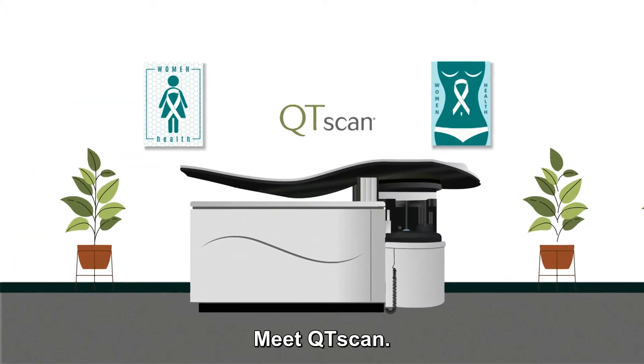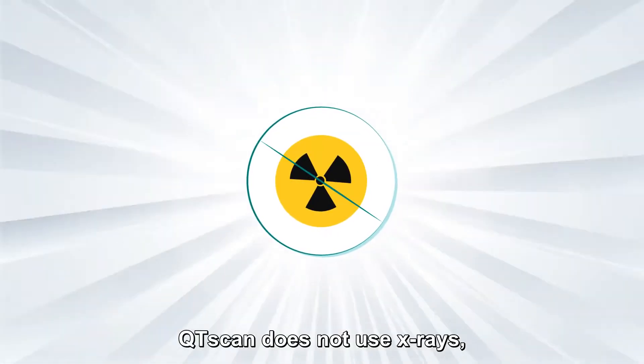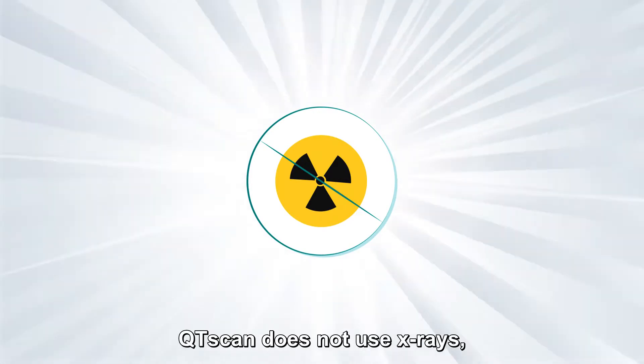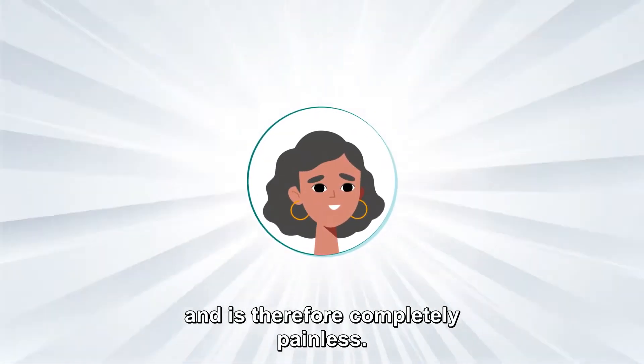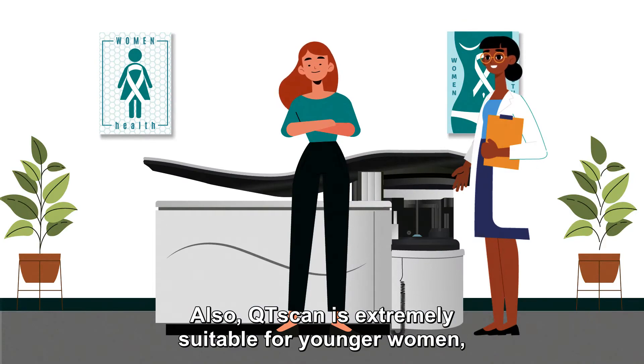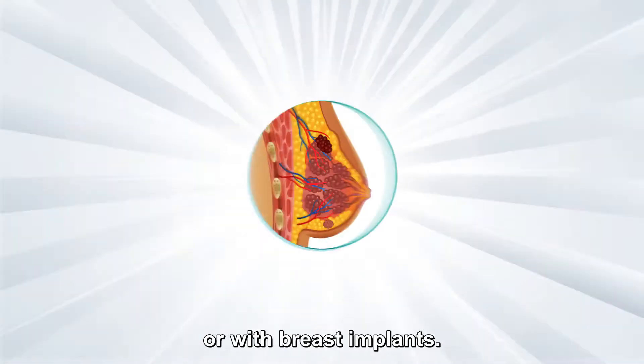Meet QT Scan, the revolution in breast imaging. QT Scan does not use x-rays, works without compression and is therefore completely painless. QT Scan is also extremely suitable for younger women, women with dense breasts or with breast implants.